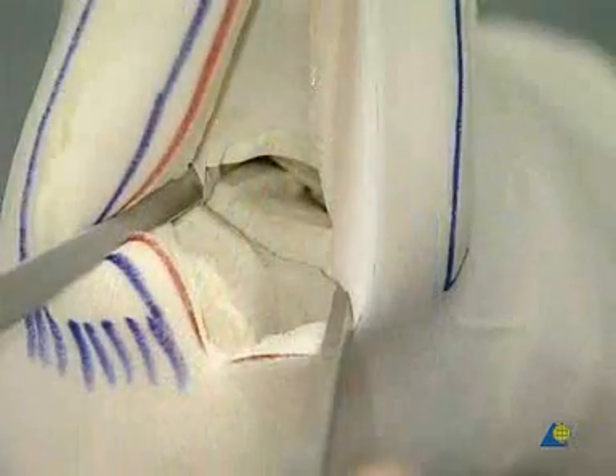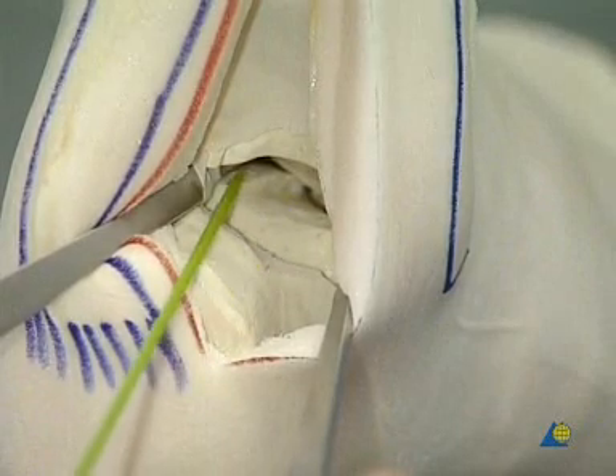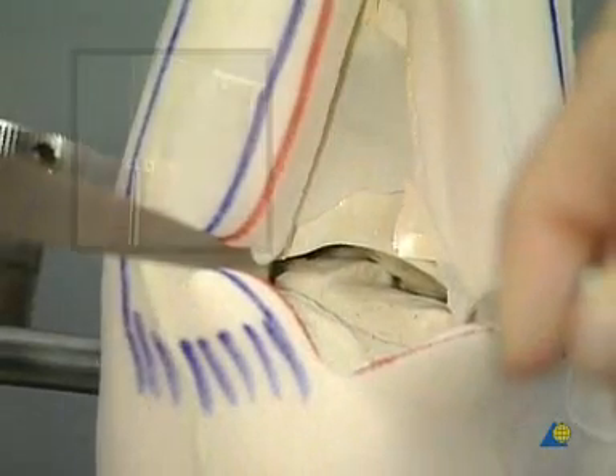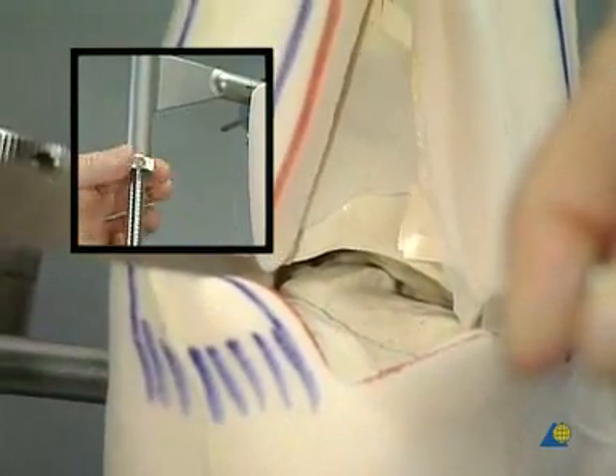The posterior facet is irregular and has a longitudinal step on the joint surface. A distractor is applied to the medial aspect of the lower leg from the tibia to the calcaneus. Distraction provides an excellent view into the posterior subtalar space.